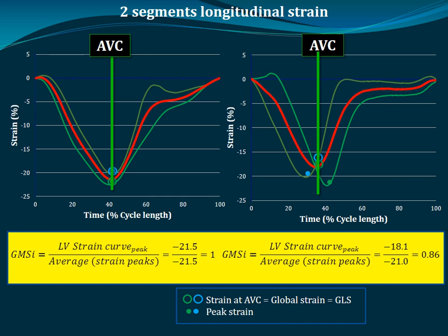This is the other term that we're looking for. If we go back to the lecture that Oren Kaspi gave in the morning, we know that there are conduction abnormalities, we know that the QRS is prolonged, so we're also looking for something electrophysiological, I mean, looking for delays. One way to assess the synchronicity of the contraction of the left ventricle is to look at how the peaks coincide.